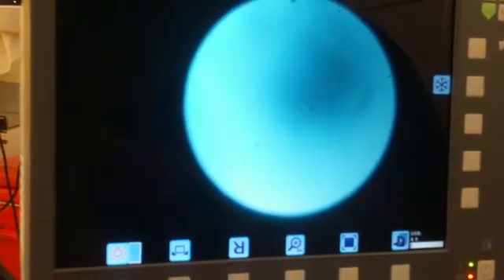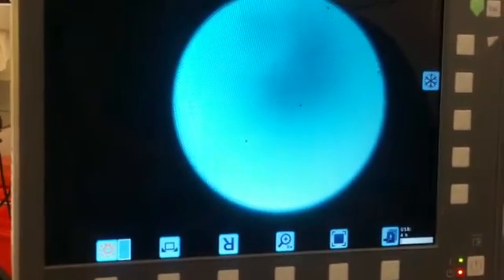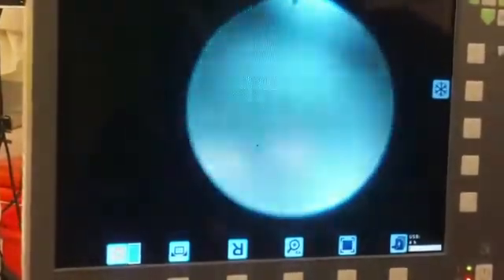How far are we going in? Well, you want to be comfortable off the end of the scope. 35. Okay, so stop there, that's fine. We're certainly well enough in, so I'll take that out. I'll flatten her off now.